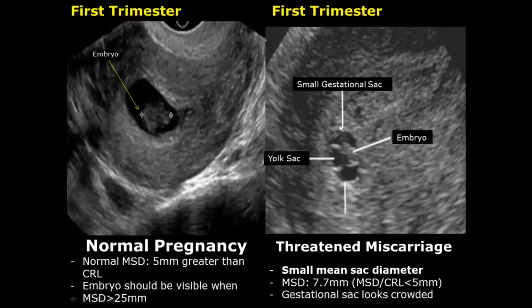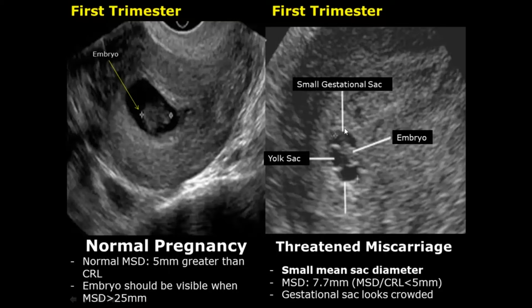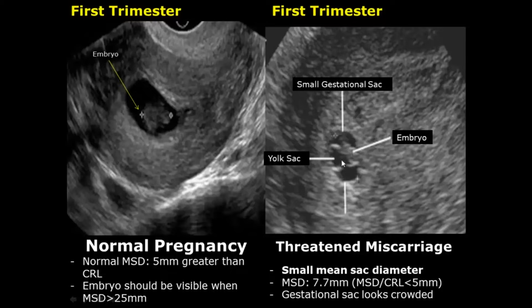The next feature is a small mean sac diameter. In normal cases, the mean sac diameter must be at least 5 millimeters greater than the crown-rump length. The embryo must be visible when the MSD crosses 25 millimeters. But here you can see the embryo and the yolk sac, yet the gestational sac is very small — the MSD is only 7.7 millimeters — making the gestational sac look crowded.